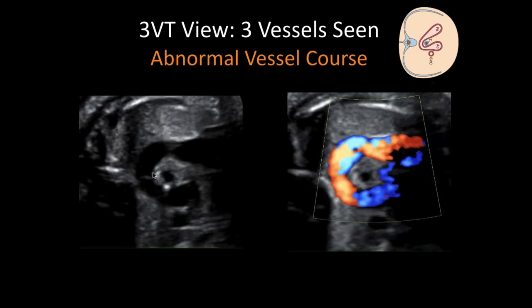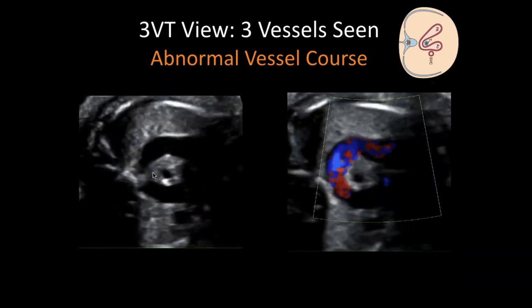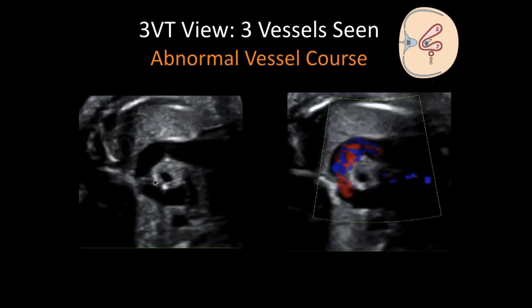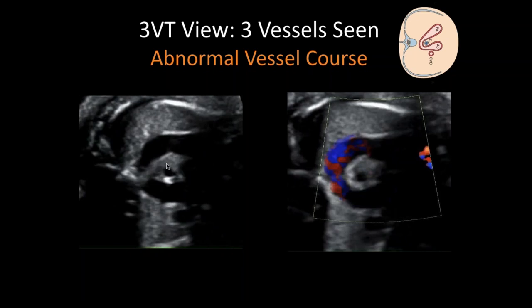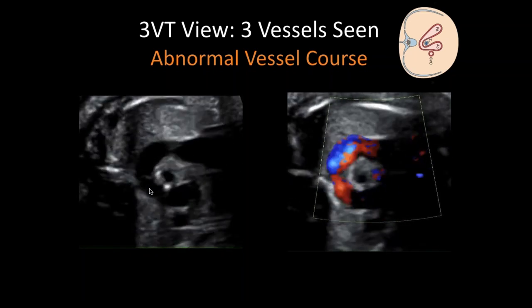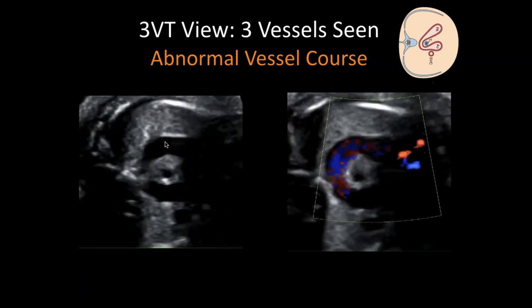Here's another U configuration here. You can clearly see the U because we're perpendicular to it. We can see a lot of the flow posteriorly. Many times when you insonate from the chest anteriorly, you're perpendicular to the flow behind the trachea, so you may not see it. If you go obliquely, you can see the whole circle surrounding the trachea.